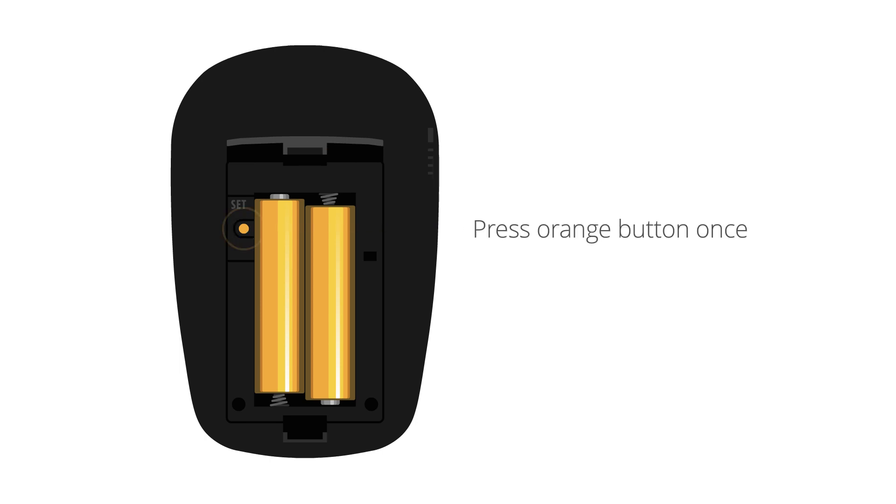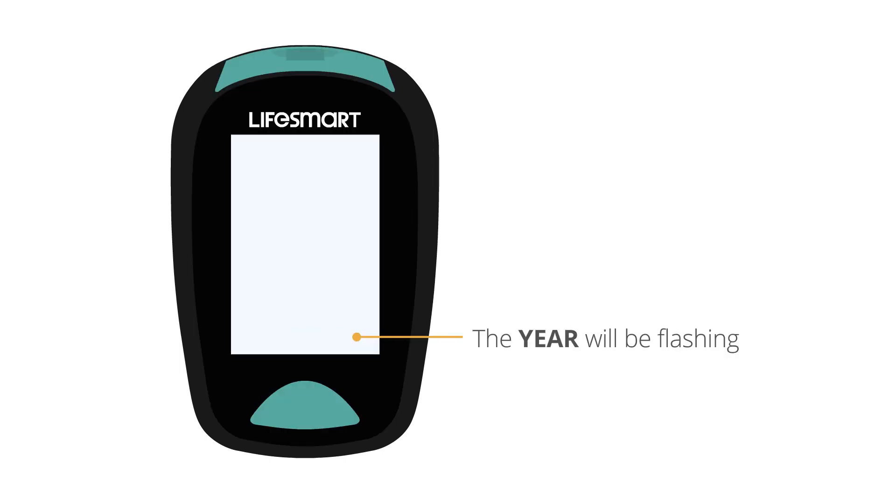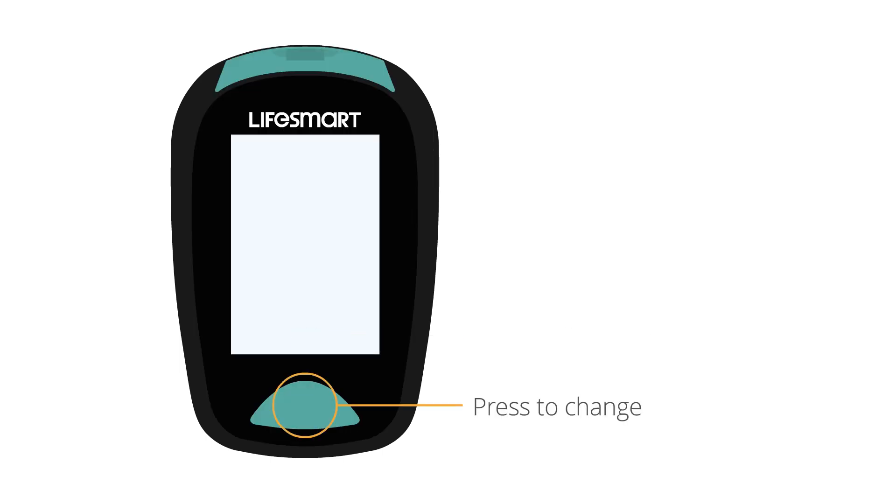Press the orange button once. The year will be flashing — press the green button to change.